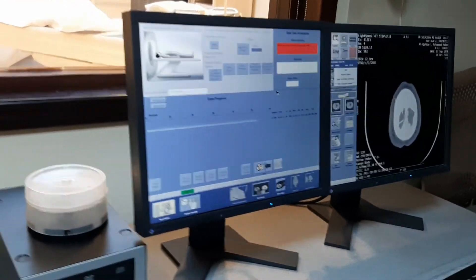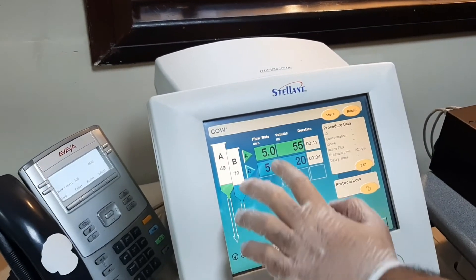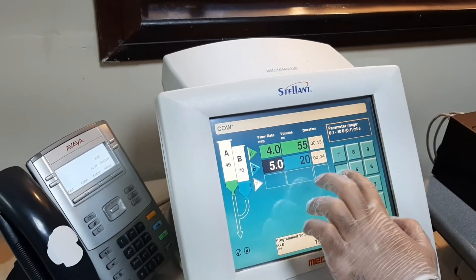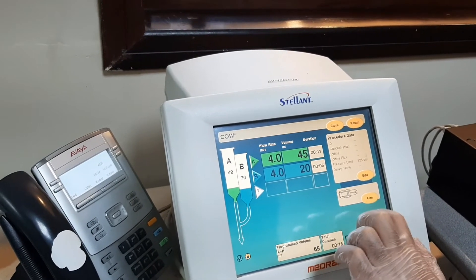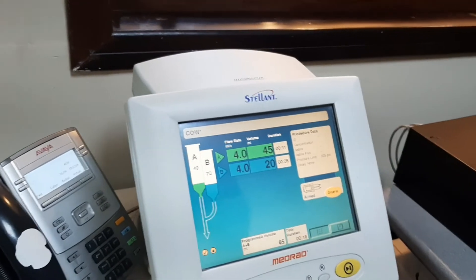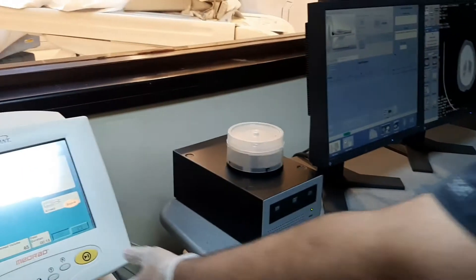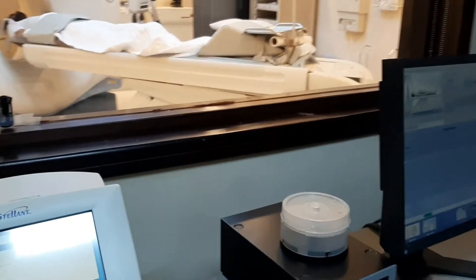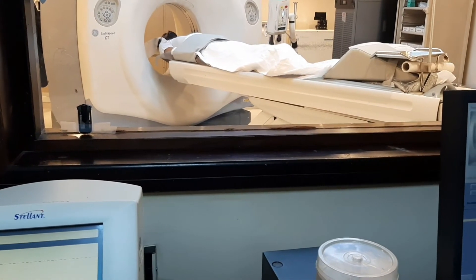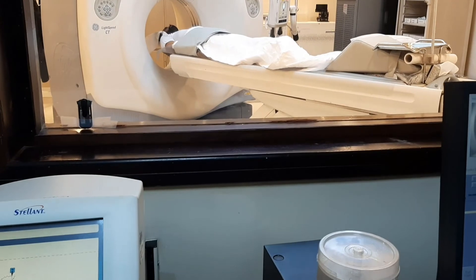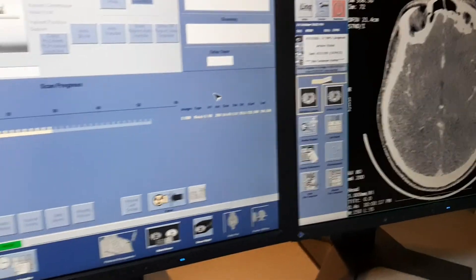Make it four — yeah, four — and then 45, 45. Yes. Now okay, move the table here, yes, together. Get together. Now you will see the table moving. I will send this one to you so that you have an idea. Okay, until we finish.